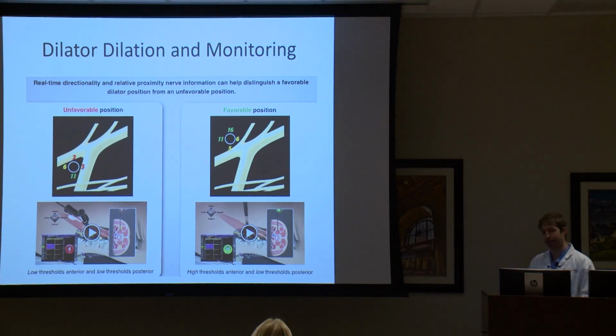Yeah, you cannot. I am not allowed to use NuVasive here. Only at those HCA facilities that I sometimes frequent am I allowed to use their stuff there. The problem is, just to divulge the honest truth, the NuVasive system was the first, and so it's probably the best. They've got all the little patents on all the nice little cool things, and people are trying to get around that.